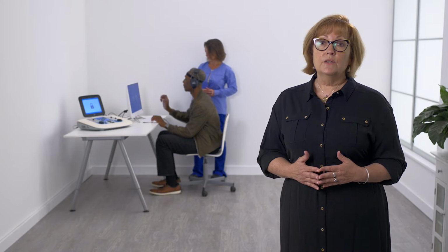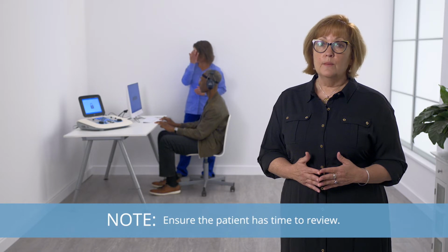Be prepared to show the patient where to touch the computer screen. This will be helpful as they proceed through the evaluation. The instructions will be displayed immediately before the AMTAS evaluation starts. If the test instructions are displayed, ensure the patient has time to review them before he presses Continue to the test. If the video instructions are displayed, AMTAS will begin testing automatically at the end of the instructions.